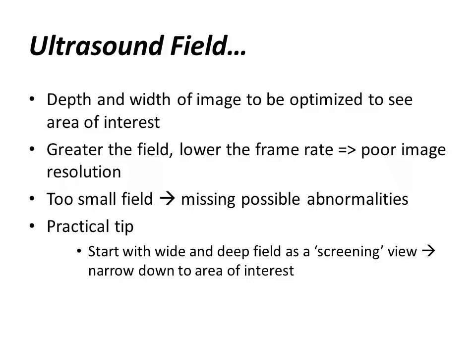A quick word about the depth. We know that increasingly we see obese patients, in general and in critical care areas, which means that there is a lot of subcutaneous fat, and unfortunately that means that you have to scan at quite a big depth.